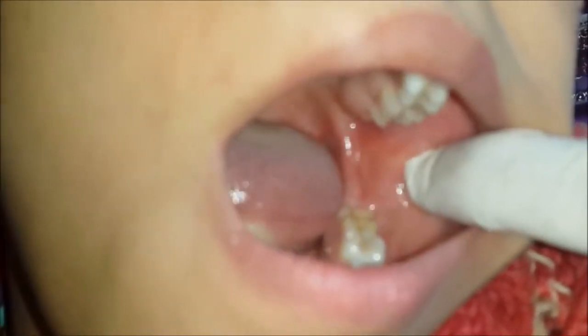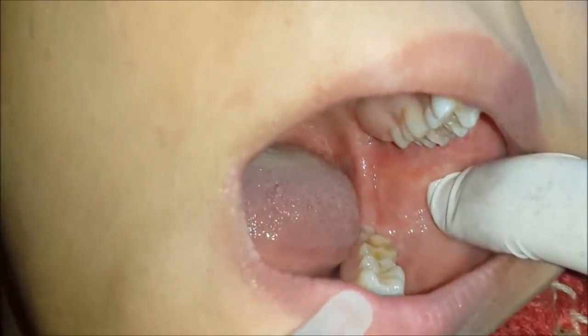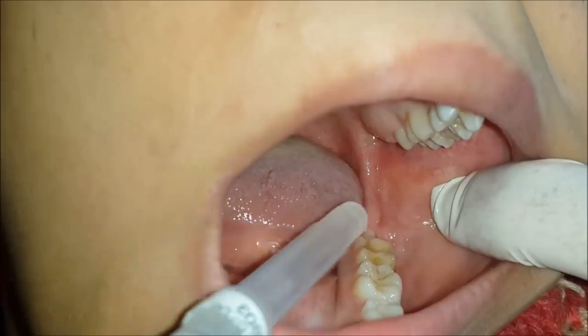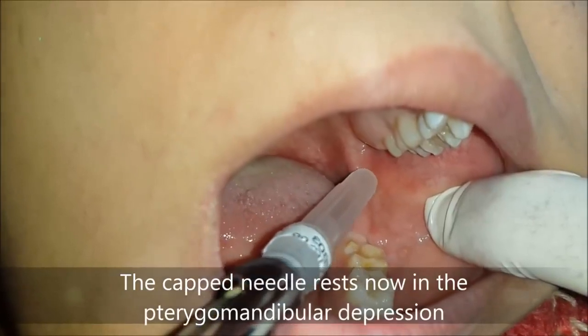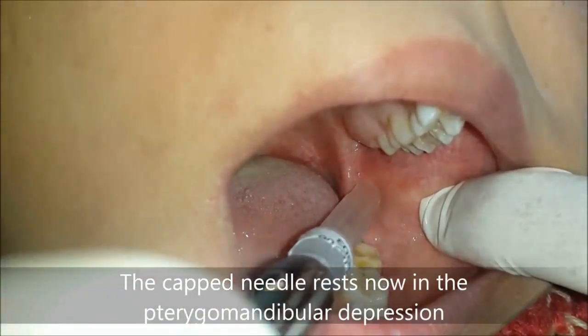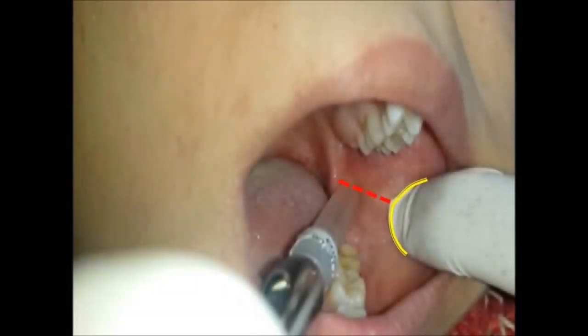Just lateral to the pterygomandibular raphe, there is a depression called the pterygomandibular depression. Right now, the capped needle is inserted into this pterygomandibular depression so that you can identify it clearly. The exact entry point is the intersection between the line we drew first from the height of the nail tip and the pterygomandibular depression. Right now, the needle tip is in the exact entry point.